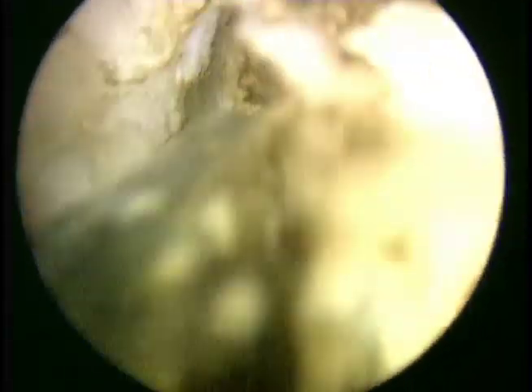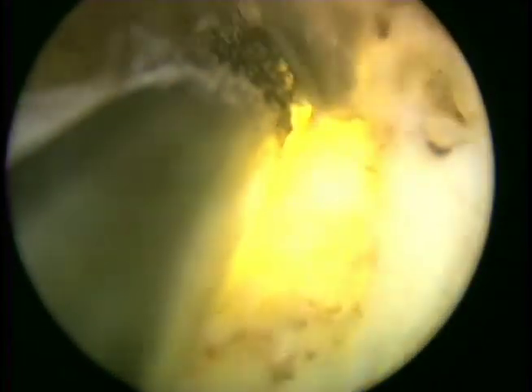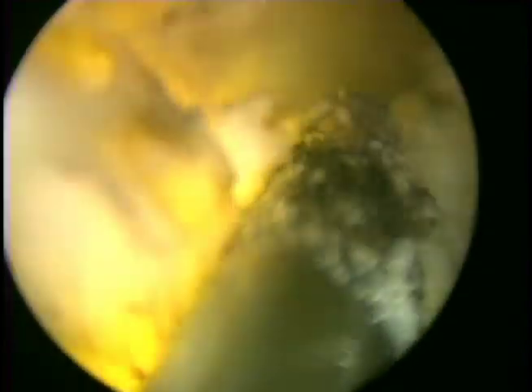Here we can see we're identifying, following that surgical capsule, sometimes encountering small little perforators, slowing things down, compressing, using the coagulation, and then following through with the same surgical plane. We can now appreciate the small stalk of tissue that has been identified and created, thereby chiseling it off and pushing it into the bladder for later retrieval is what our plan will be.